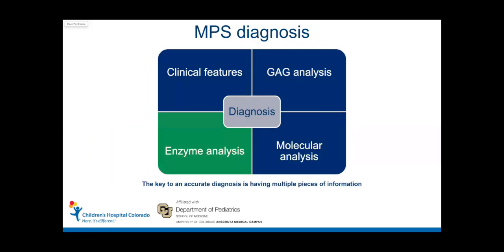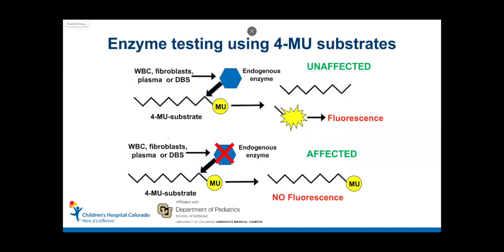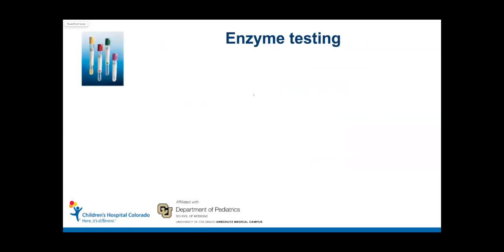So the second part of that diagnostic puzzle that I want to talk about is enzyme analysis. This is also called a functional analysis. And one of the things we need is we need the enzyme to not be degraded, and I'm going to go over that a little bit. So how does an enzyme analysis work?